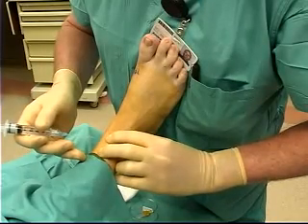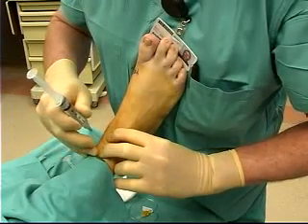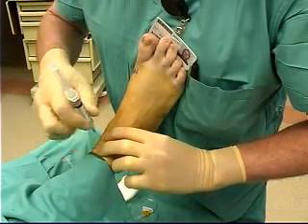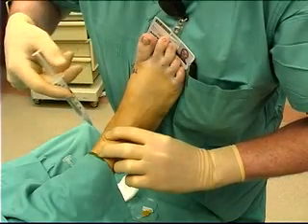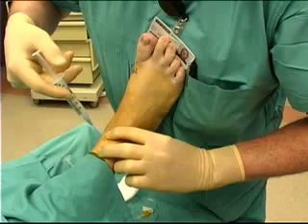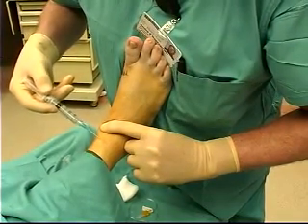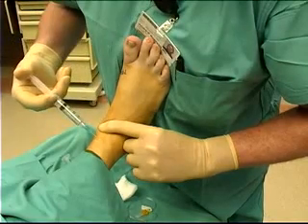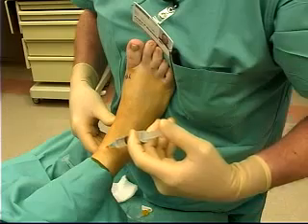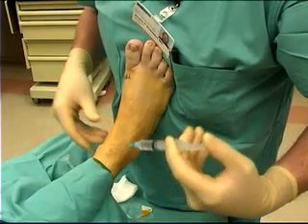Taking care to remain proximal to the retinaculum that approximately joins the medial and lateral malleoli, the tendons of the anterior tibial muscle and extensor of the big toe are palpated. Lidocaine is injected all the way down to the tibia bone between these 2 tendons. The same needle entry site is used, and the lateral subcutaneous area to the fibula is injected with lidocaine. The area around the saphenous vein is also anesthetized using the same needle entry point.